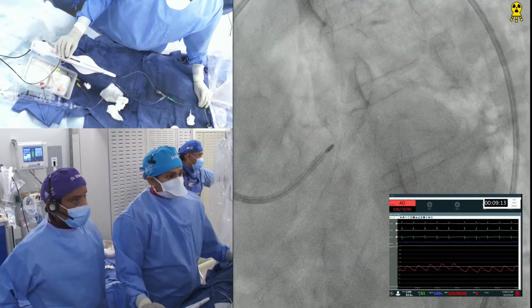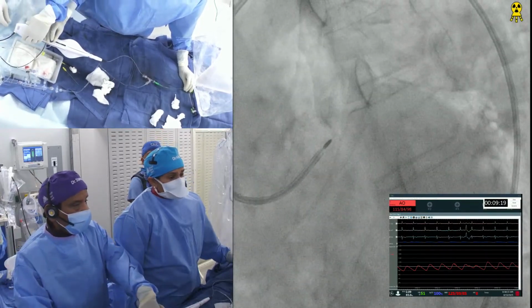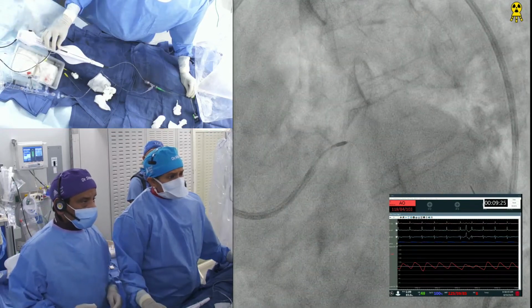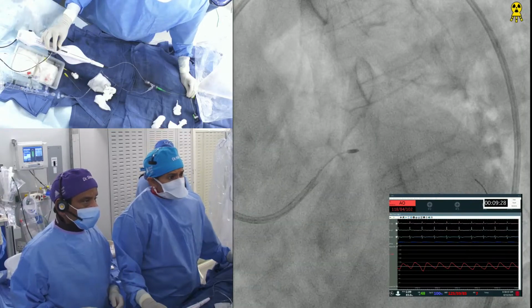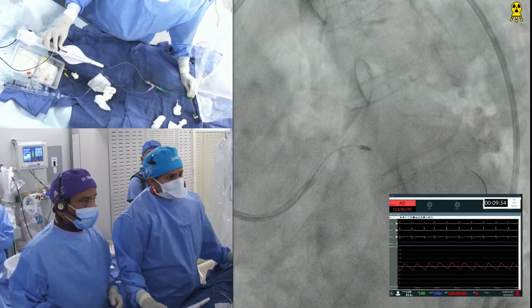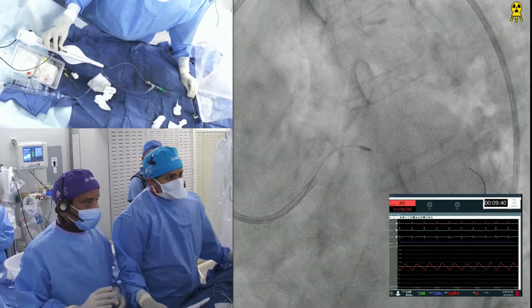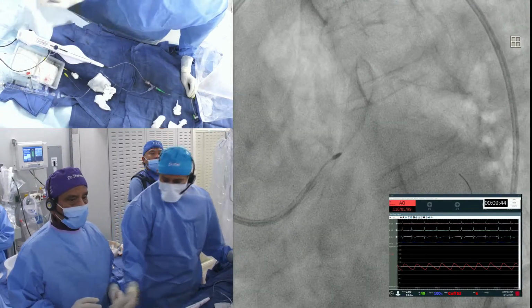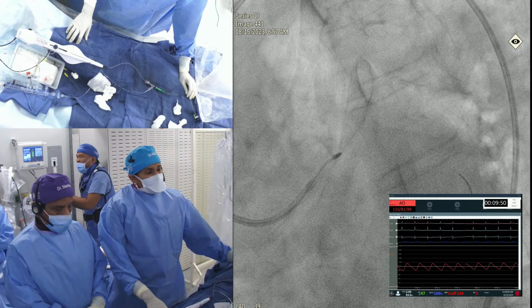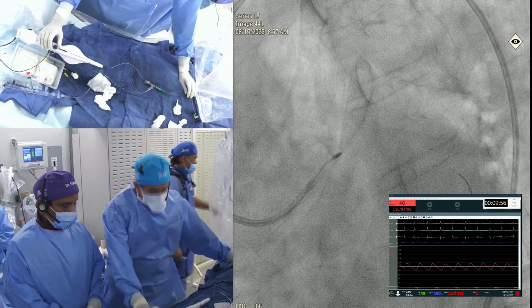Yeah, now we just pull the guide. Yeah, that's it. But the wire has to go further. The wire is coming out. Okay, wire can go. Oh, no, okay, no, wire is stuck. So you saw that it did make a little curve, a turn, with a low speed, but that's only by pulling the guide backwards. Made it a little coaxial.